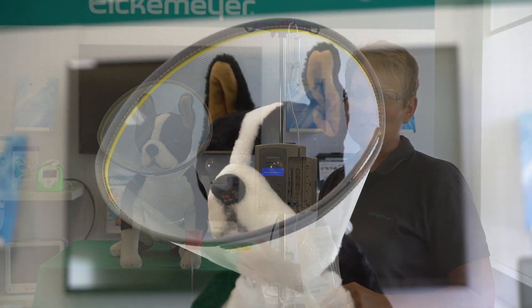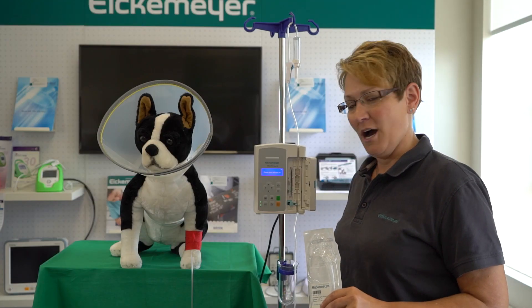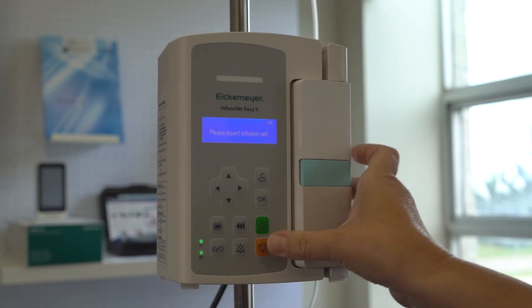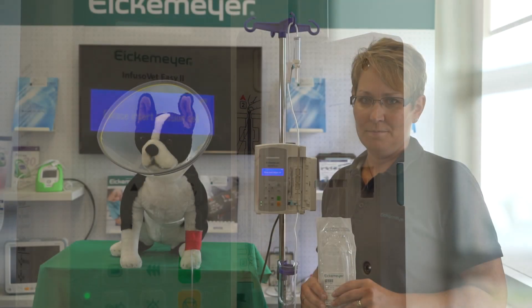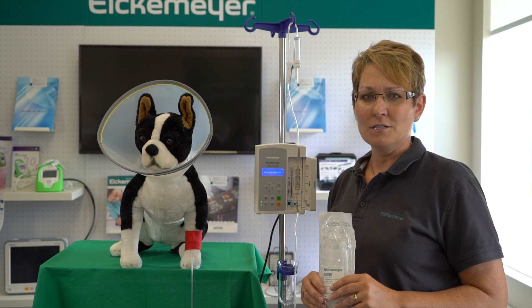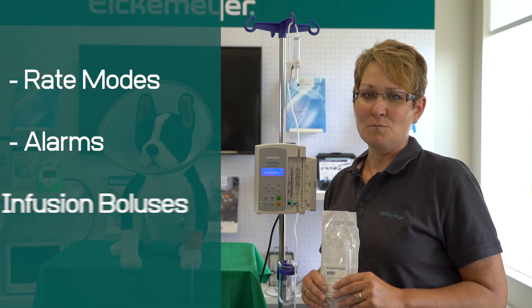Our mascot Eich is hooked up to our InfusoVet Easy II infusion pump with our IV pole. As you can see, it is easy to hook up and comes with a lithium-ion built-in battery. It has multiple parameters such as rate modes, alarms, and infusion boluses.